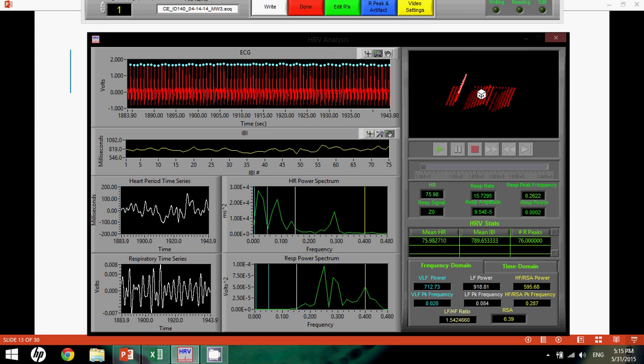One other cool function is that you see a waterfall plot right here of all the ECG data in this particular segment. You can mess around with this. It's fun to look at. It doesn't really tell you very much unless you're an expert at really understanding what the ECG data means and how to interpret it. So for the time being, it's really just important that you see all the information in this main screen. All this additional information down here is important if you're an expert and you can interpret it. However, it's unlikely that you'll probably know what that means.